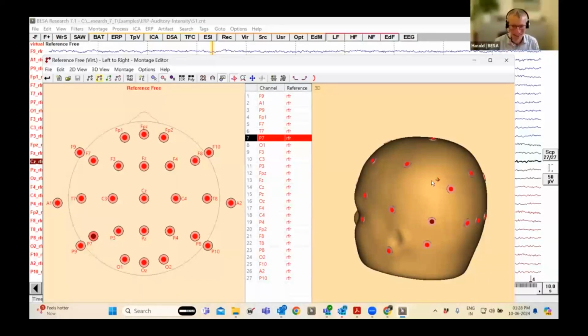Oh, sorry, I was just busy writing in the chat. So what was you saying? Yeah, sorry. I was saying that with this reference-free electrode system, the montage, what we are showing actually is the zero integral reference with each of the electrodes. Yeah, certainly correct. Okay, great. Thank you.